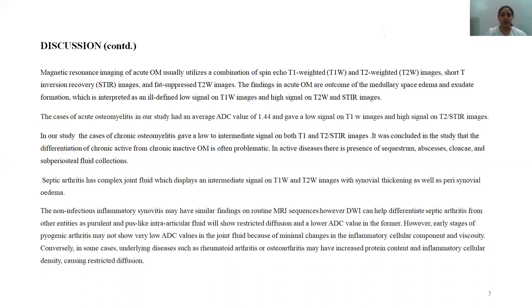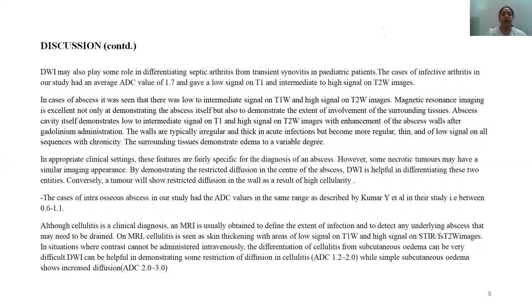Septic arthritis presents as complex joint fluid displaying intermediate or heterogeneous signal on T1 and T2 weighted images with synovial thickening and perisynovial edema. Non-infectious inflammatory synovitis may have similar findings on routine MR sequences. However, DWI can help differentiate septic arthritis from other entities as purulent, pus-like intra-articular fluid will show restricted diffusion and lower ADC value. Early stages of pyogenic arthritis may not show very low ADC values due to minimal changes in inflammatory cellular component and viscosity. Conversely, underlying disease such as RA or OA may have increased protein content and inflammatory cellular density causing restricted diffusion. The infective arthritis cases in our study had an average ADC value of approximately 1.7, with low signal on T1 and heterogeneous to high signal on T2 weighted images.